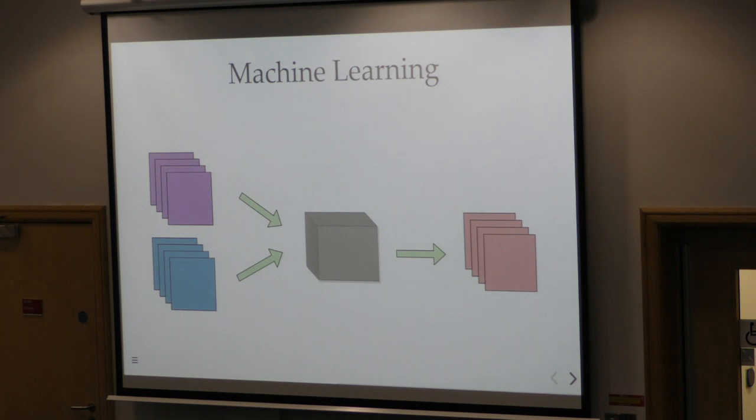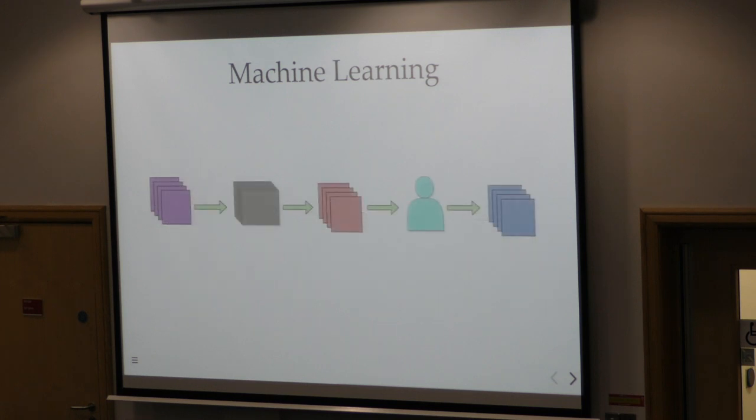And when I say near perfect, it means they still require some kind of human attention for 2 reasons. One is that they're near perfect, they're not finished, and another reason is that they need to be verified. So in order for our segmentations to be trusted, seeing as they're being used for a medical device, we need to have a human verify that they're good. So what we end up with is a process that looks like this image here, where we have our medical images, we feed them into a black box, it does the segmentation, which is then taken by a human and corrected into a segmentation which will hopefully be perfect.